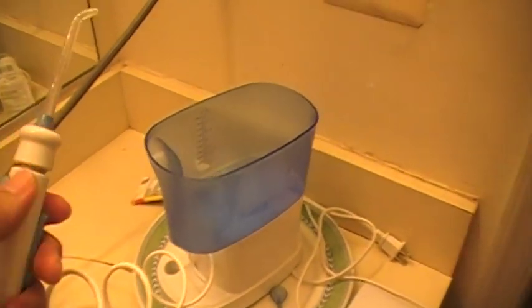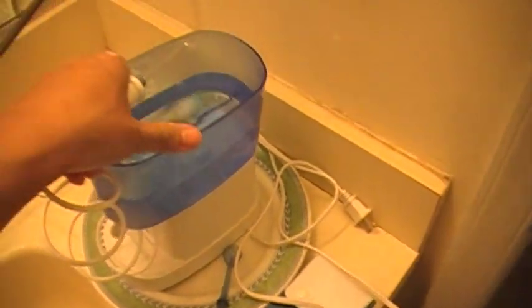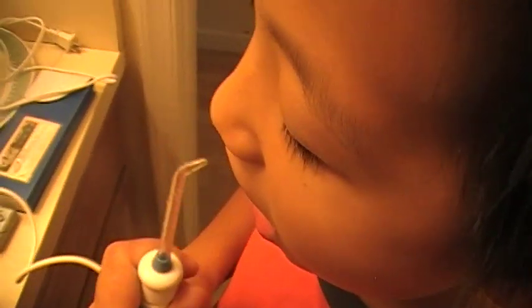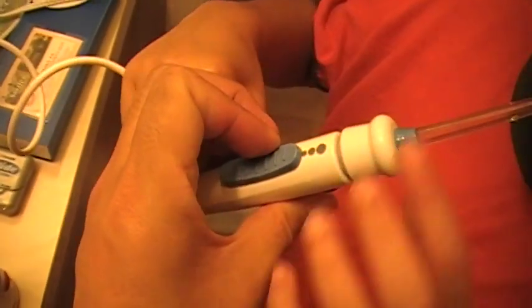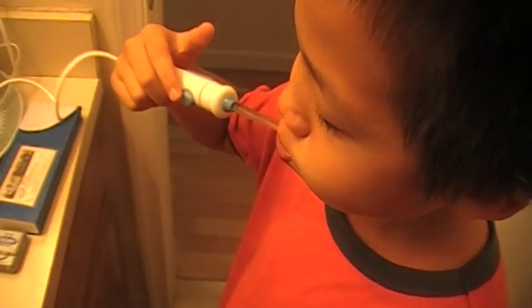After that's done, you can use the water pick. The water pick machine can be found at any drug store. Put warm water in the top cup, then place it on the water pick. In the mouth, push the little upper lever so that it will start to work — push the water up and let it wash.